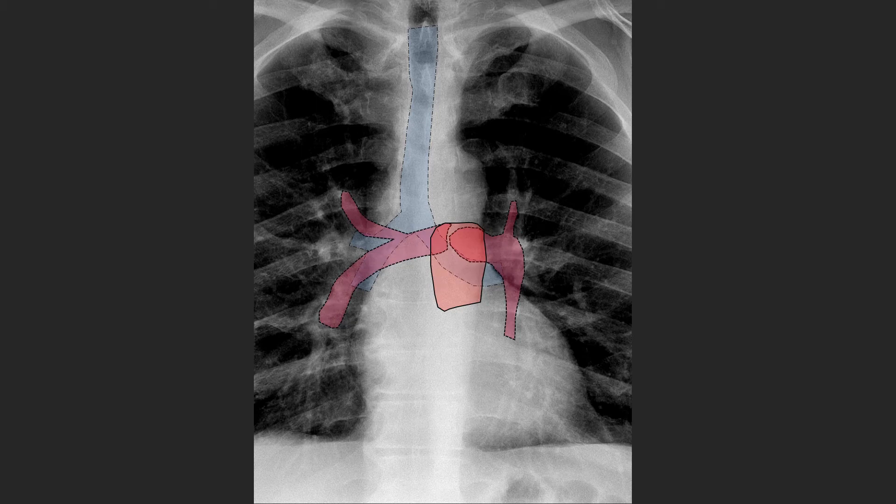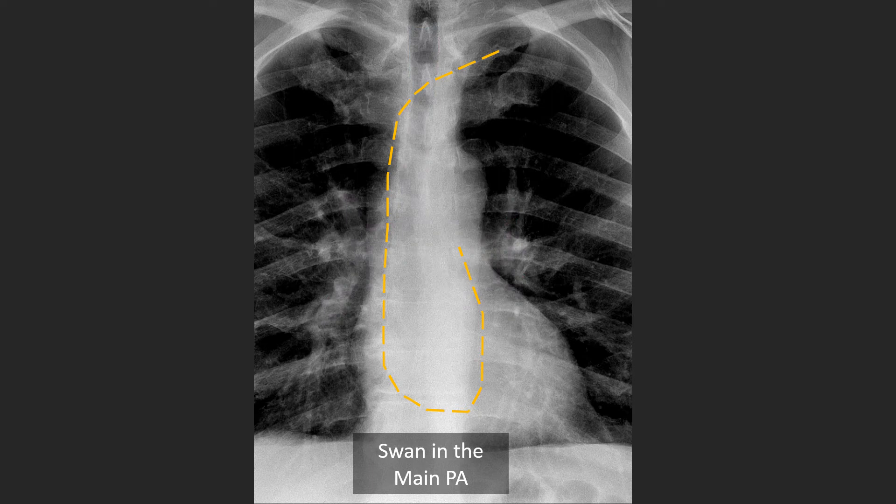Let's look at some examples. This would be an example of a Swan-Ganz catheter within the main pulmonary artery — you can see the location of the tip, which is just above or just below the left main stem airway.